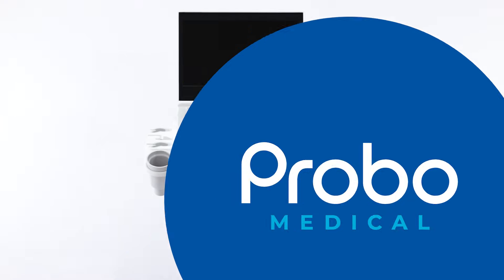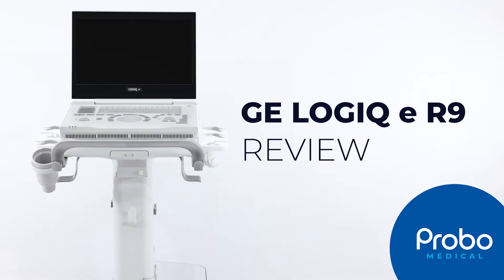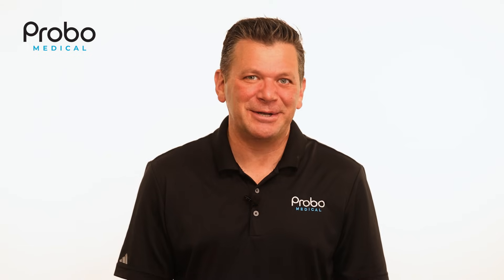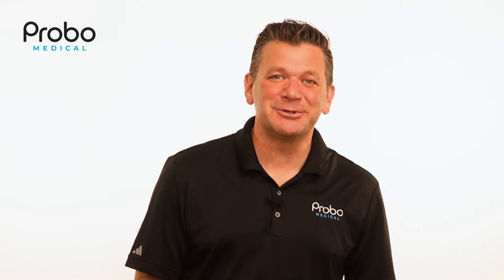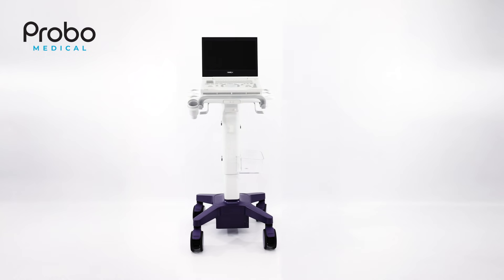Is the new Logic E R9 just a pretty face, or is it something special? As the best-selling portable ultrasound ever, the GE Healthcare Logic E has sold over 12,000 units since 2008. The latest version, the R9, has a new modern design as well as some new features.